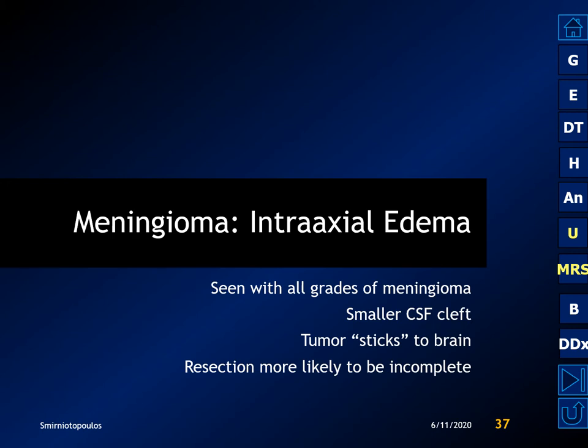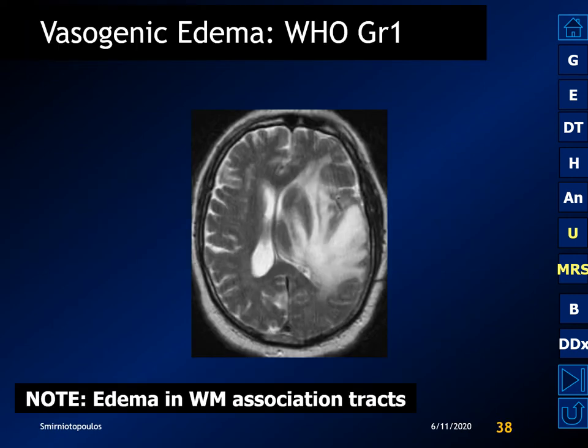Meningiomas often have intraaxial vasogenic edema. This can be confusing because it may misdirect you into thinking you have an intraaxial lesion. Intraaxial edema is seen with all grades of meningioma. It's associated with a smaller CSF cleft and also with microscopic invasion or stickiness of the tumor to the brain. In these cases, resection is often less complete, allowing for tumor recurrence. Here's an example of a WHO grade 1 meningioma with very extensive intraaxial vasogenic edema.